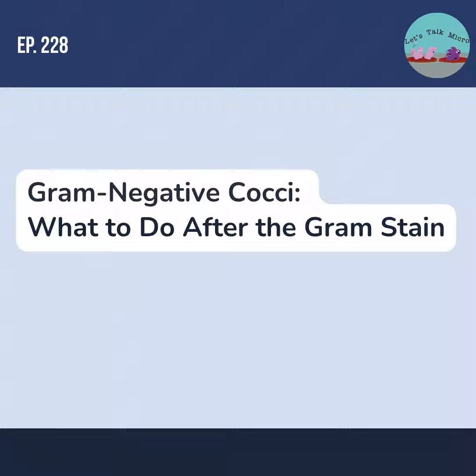And as I mentioned before, sometimes you can confuse it with a gram-negative cocci, but I always advise you to scan the slide. Even though you see these plump coccobacilli, if you look around, you're going to see some that are rod shaped. So really look for that. It's not going to be thin rods, they're going to be thick bacilli, but scan around. That does not happen when you have Neisseria meningitidis. So keep that in mind.